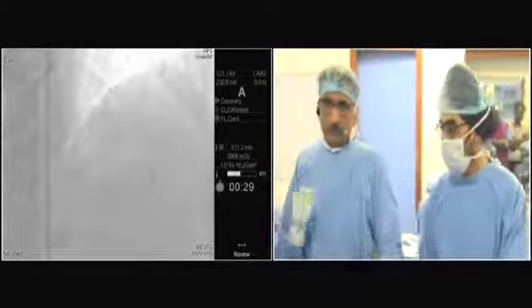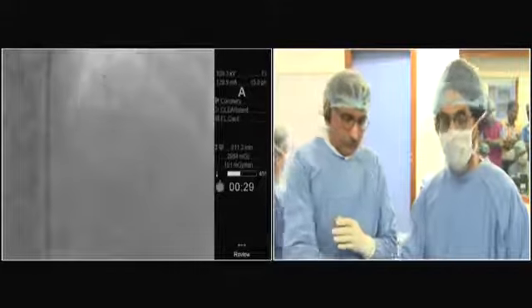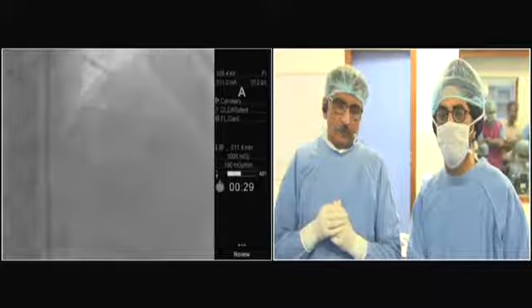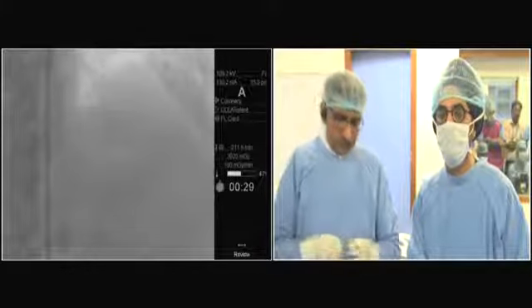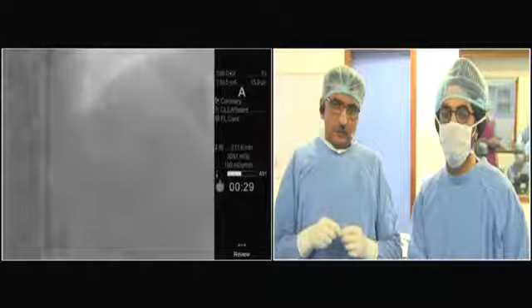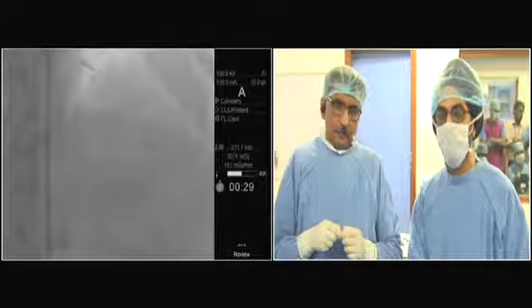So go up 10, 12, 14. So this is a 2.0 balloon. 16. Down. 16, 18, 20. Down. 16, 2.5 balloons. Down. 18. So this is a 2.0 balloon. 2.0 balloon? Yes. Down.